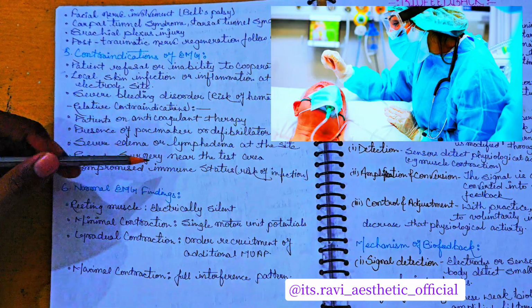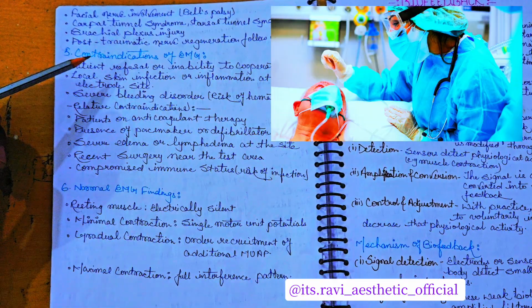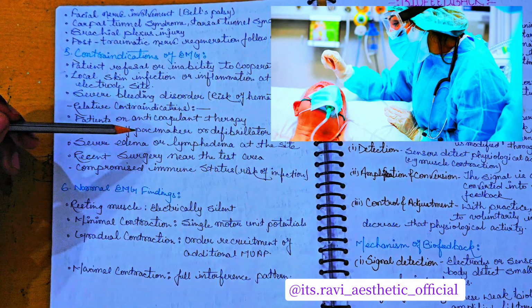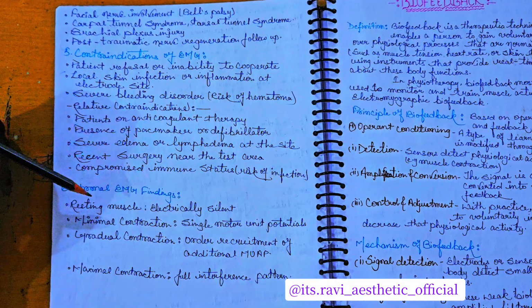Compromised immune status, with risk of infection. Since the equipment is used day by day and patient to patient, we must maintain hygiene and disinfect the fine wire and surface electrodes used from patient to patient.